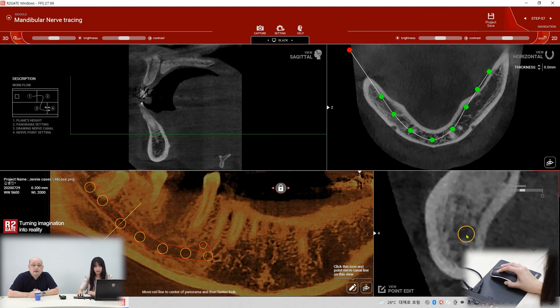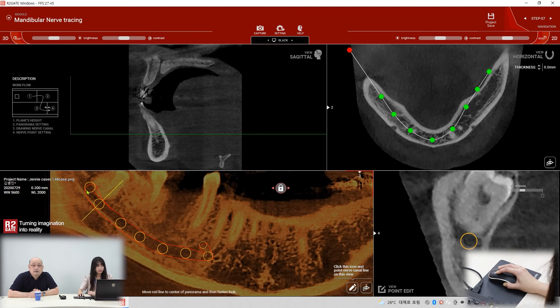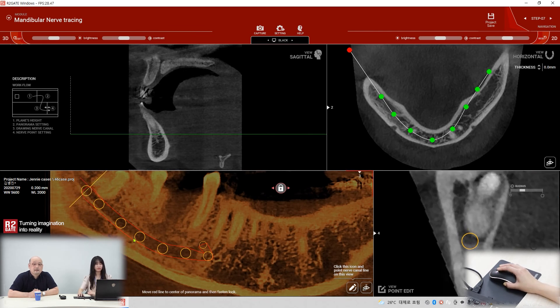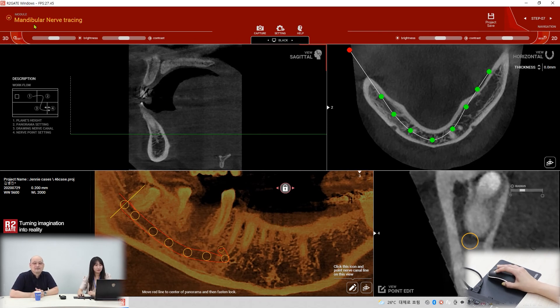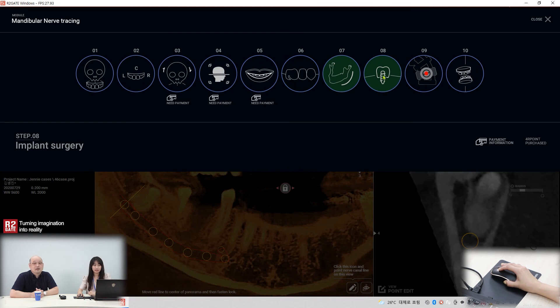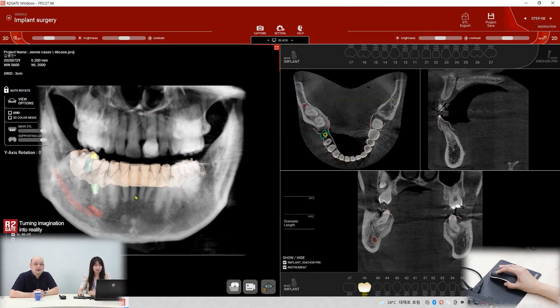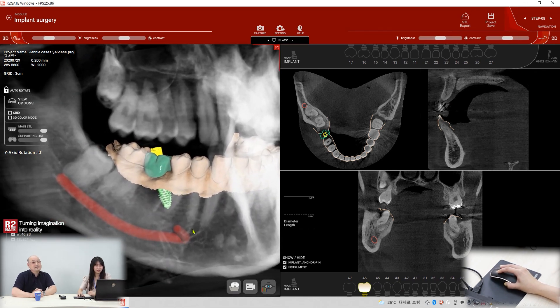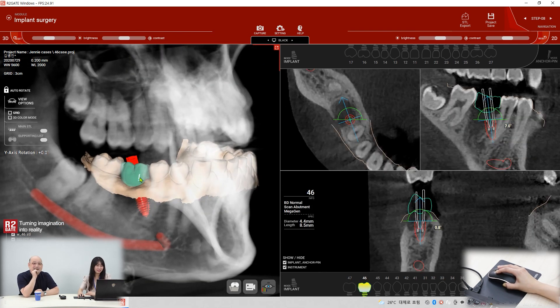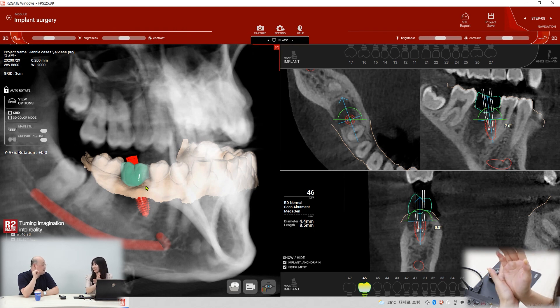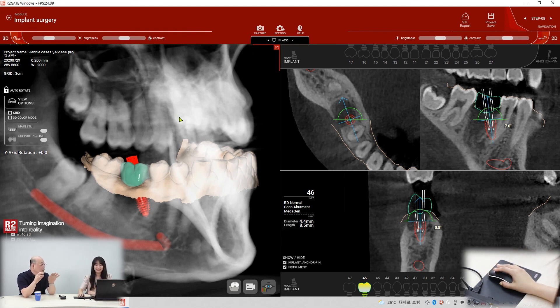Okay, it's the same. Jenny said good — that means it's done. So where's the nerve now? That's the implant planning — Step 8, implant planning. There's the nerve — the red line is the nerve. And there's the wax up also. The implant is already placed. The wax up position is automatic — if you decide the wax up position, then the implant will be loaded at the same positions.